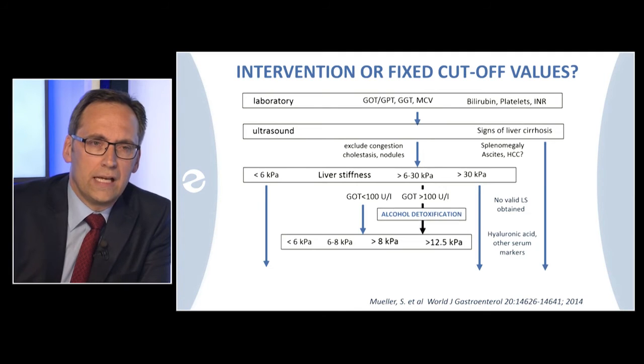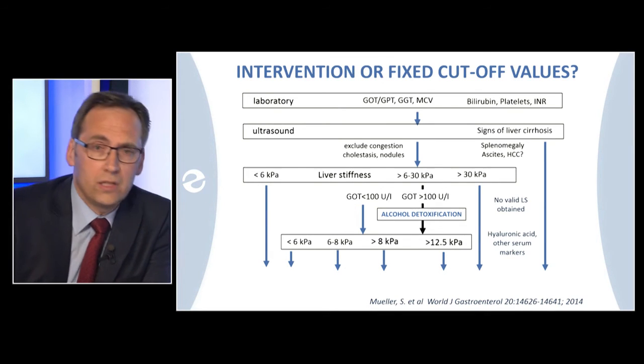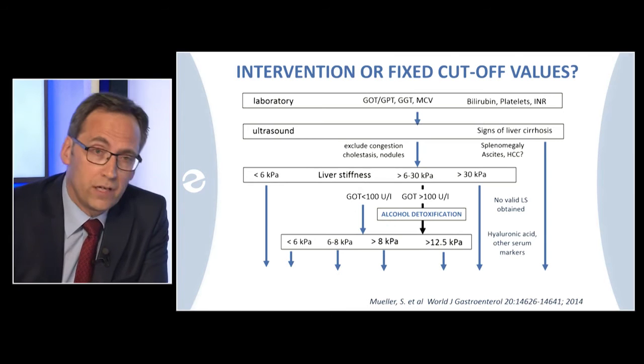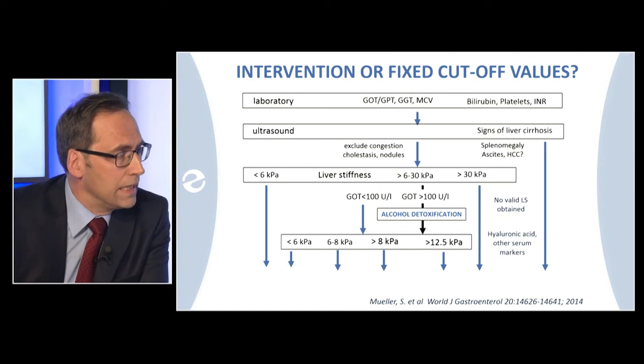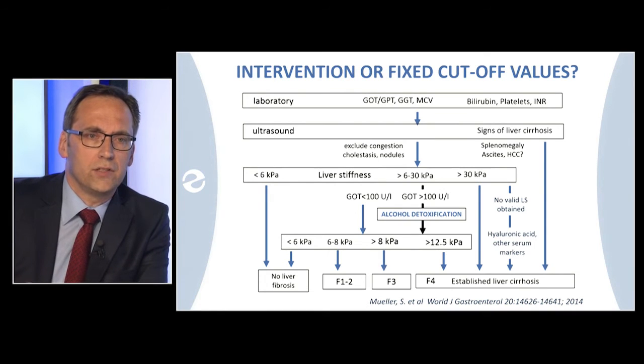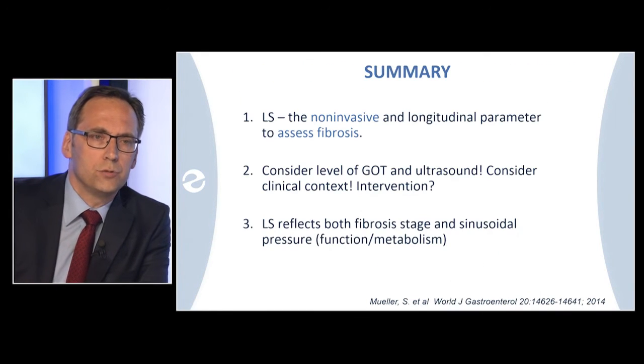And I'm now going to hand over the talk again to Ramon, because I mentioned here, what do you do? We have it sometimes in 5%. What if we cannot measure liver stiffness in these patients? And we were not able to do this.